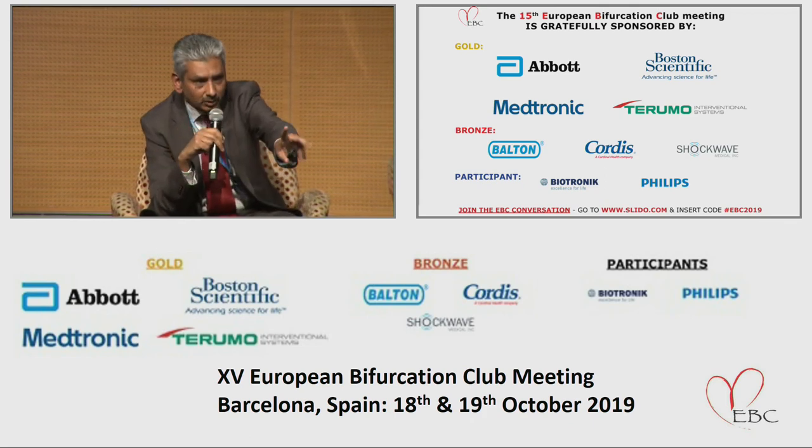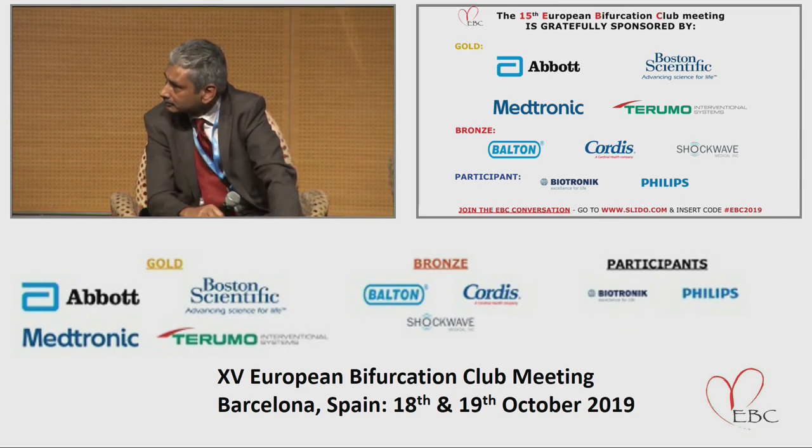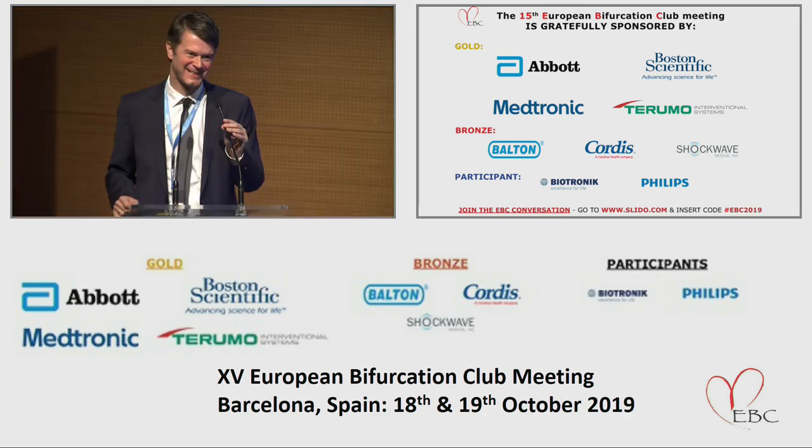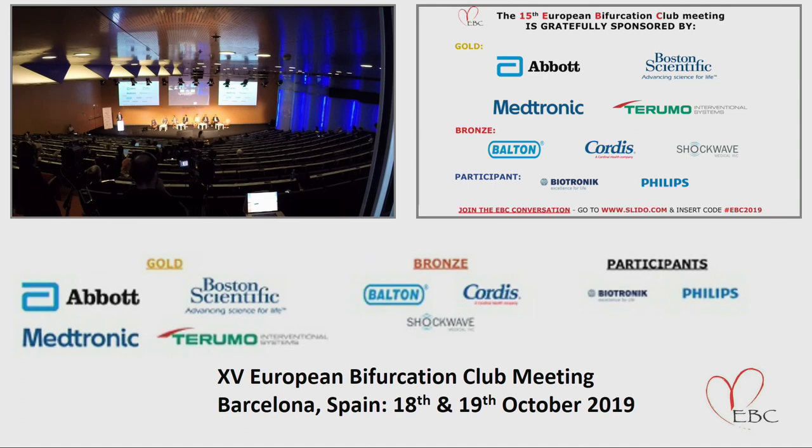Two more questions from the audience, one from Eve and then from Tom. My question is for both you, Klaus, and also for Dr. Alfonso. We have been proposed a scoring drug-eluting balloon by Philips. It was 2 years ago, I think. We had discussed yesterday, last year, building some study to have data, because they want to sell, but they have no data. So do you think this is a good idea or not? A drug-coated scoring balloon.